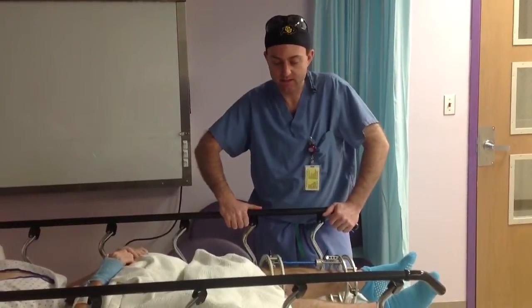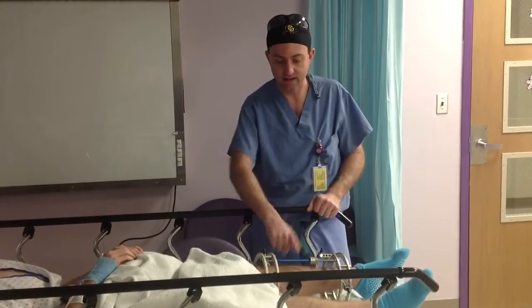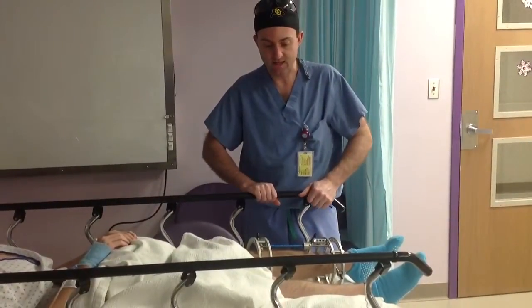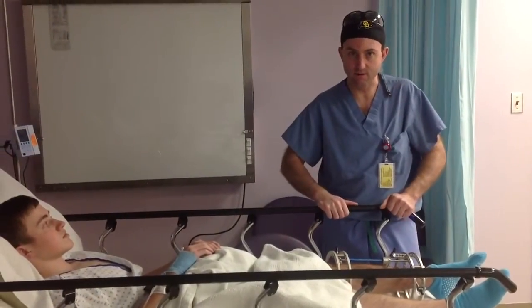The way it works is we put two metal rings above and below where we want to make the bone longer, then we do a little surgery and cut the bone in half. We create motors that attach the two sets of rings together, and each day Brendan spins them four times a day. They grow about a millimeter, and that's about as fast as you can grow a bone each day.